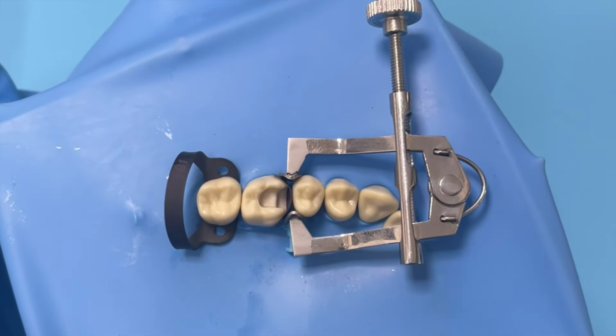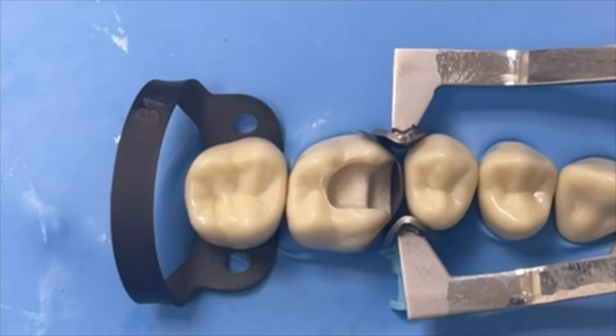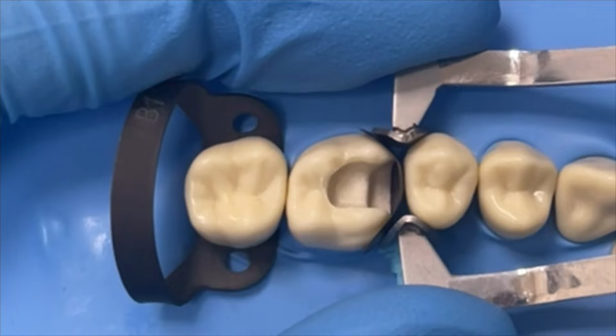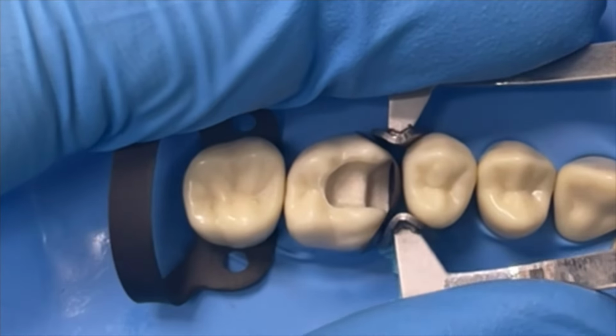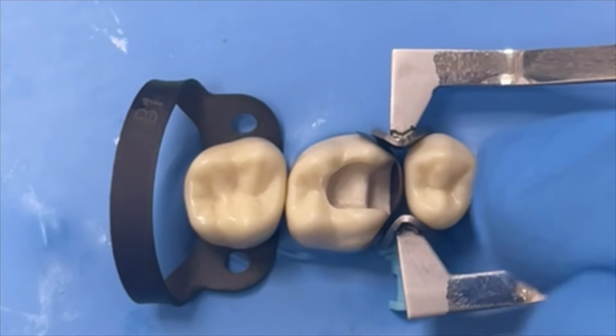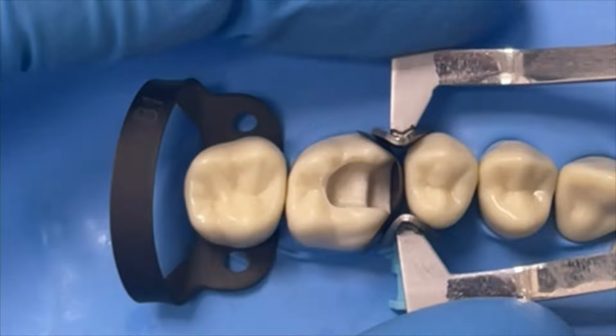I'm just going to zoom in a touch. But you know, if that was just a little bit too much or starting to buckle, I can just take a little turn off the ring, or I could tighten it a little bit more. You see, if I keep going and going, that's going to start to buckle in, and that is what happens with the rings when we can't control the tension that's put on them.